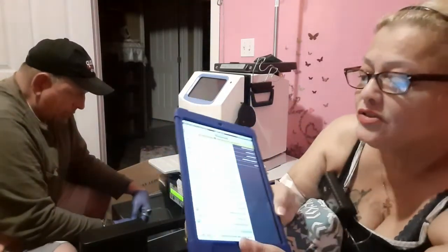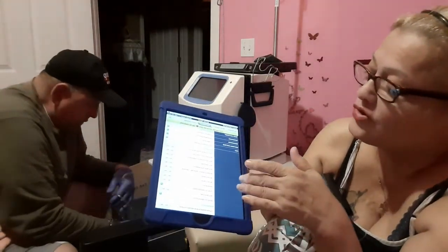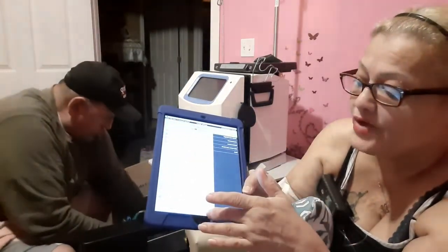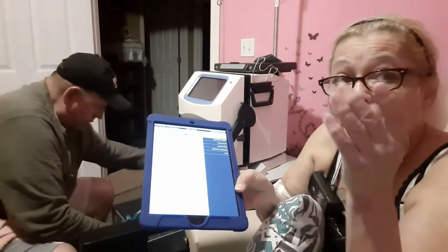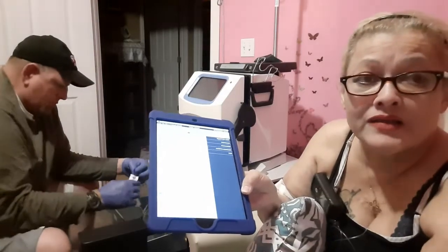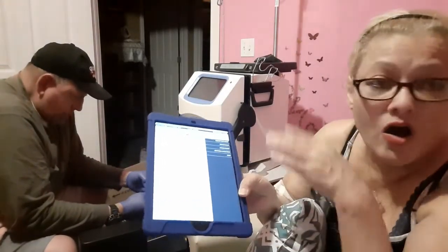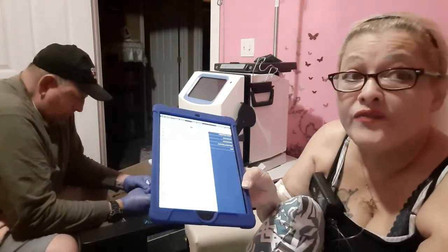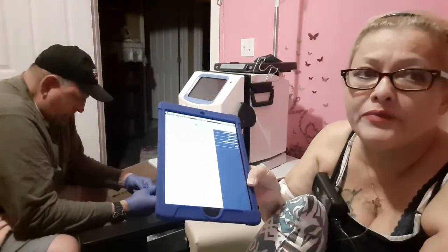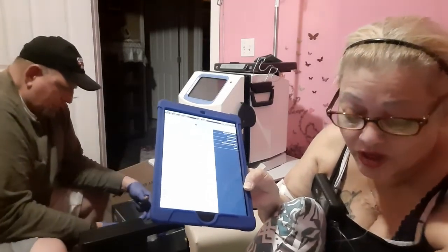But anyway, so this is the post-treatment charting that I'm getting ready to do now. And then that's it. Then I send it to my team at the clinic. And she'll come in tomorrow and she'll see my treatment. She'll see all the information. You know, if there's anything off, she'll call me and let me know. Or she'll come out here. So it's all cool. It's all good.